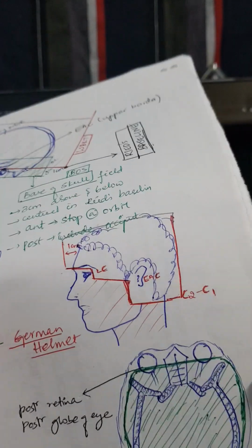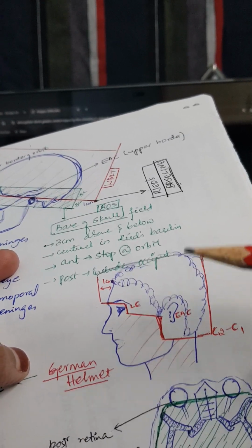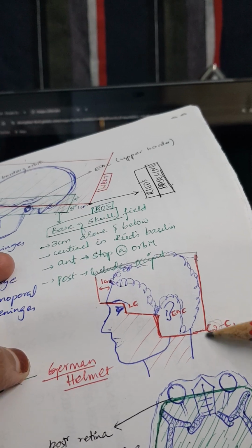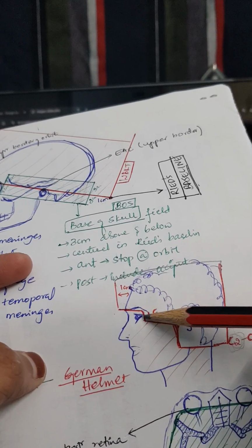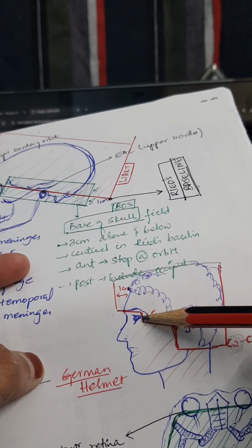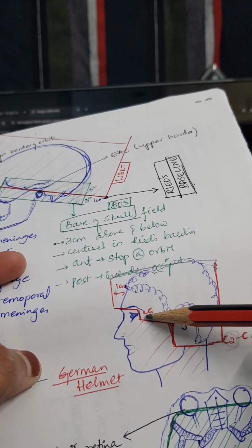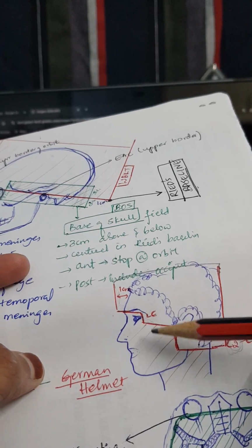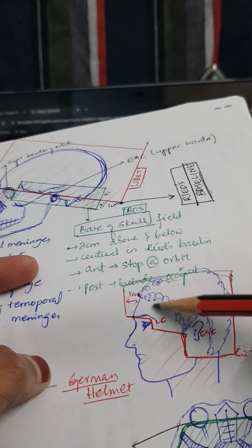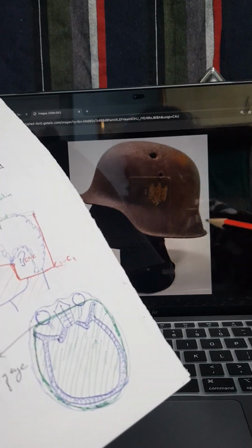Then coming to German helmet as such, it's usually used in PCI, that is prophylactic cranial irradiation, and the inferior border will be C2 vertebrae, that is the bottom of the C2 vertebrae, and anteriorly will be the 1 centimeter fall off as such, but 2 centimeters inferiorly, 2 centimeters posterior to the lens. And here we will also try to include the cribriform plate. Here we are trying to include the optic nerve, cribriform plate over here. Now, this gives that shape of our German helmet as such. That's why it's called German helmet technique.